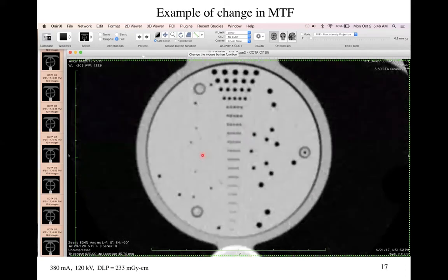This is the image when we use approximately 5 times the amount of photons, and therefore the detector array doesn't have a ridiculous amount of noise on it. We don't do as much averaging over the detector array, and now we can resolve these finer lines.